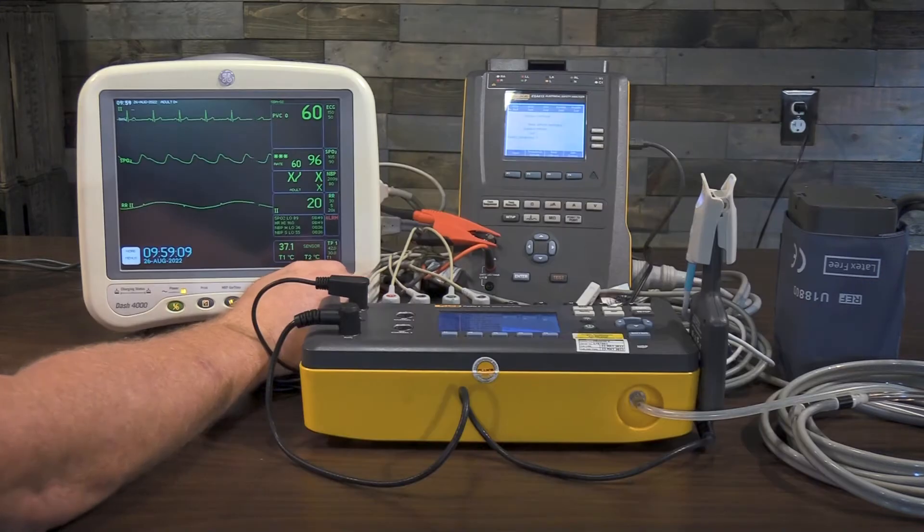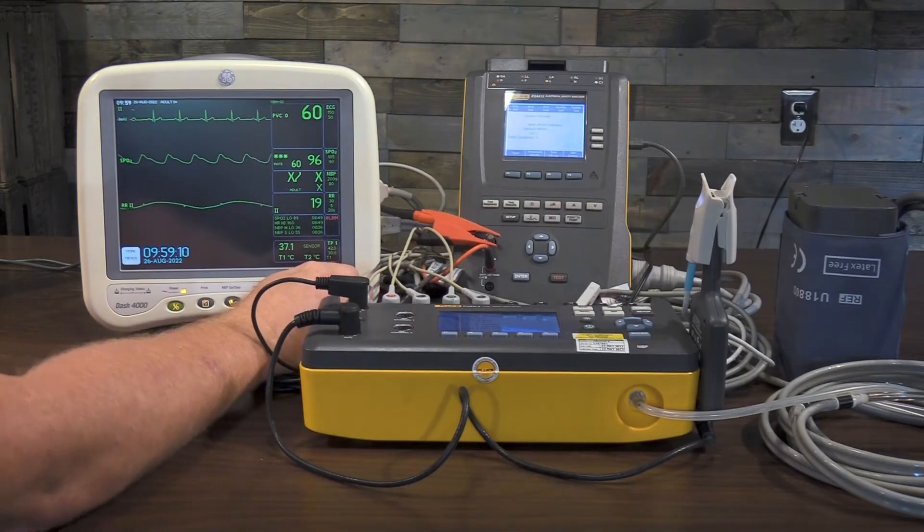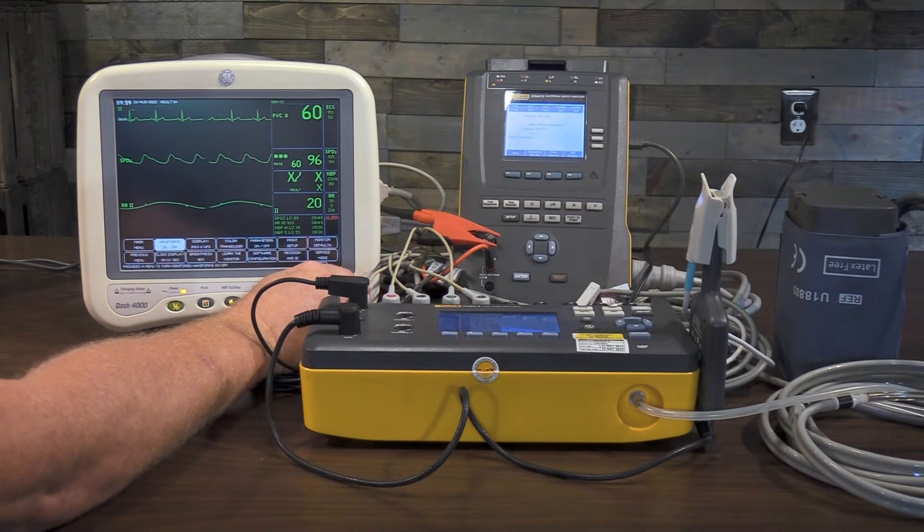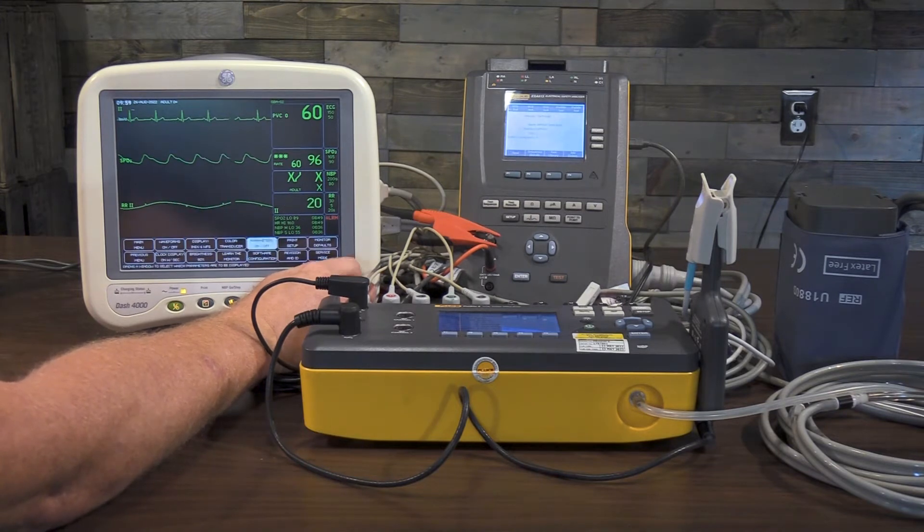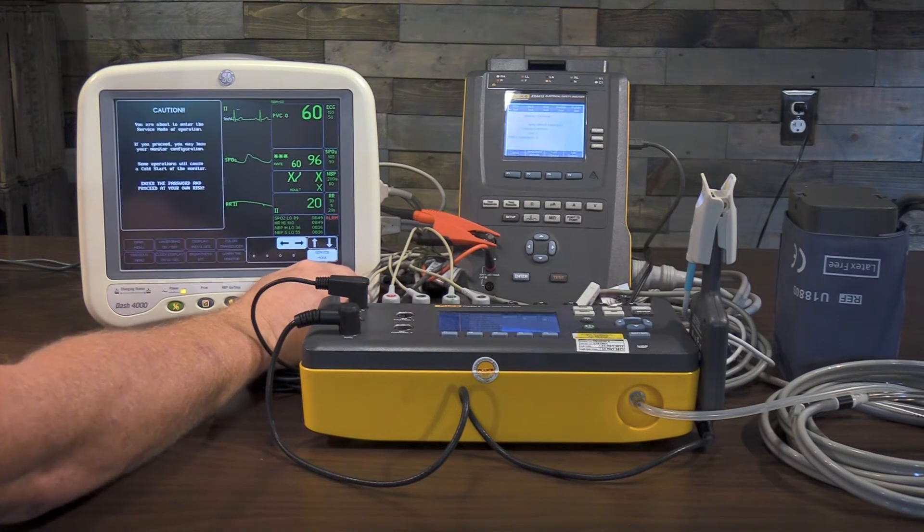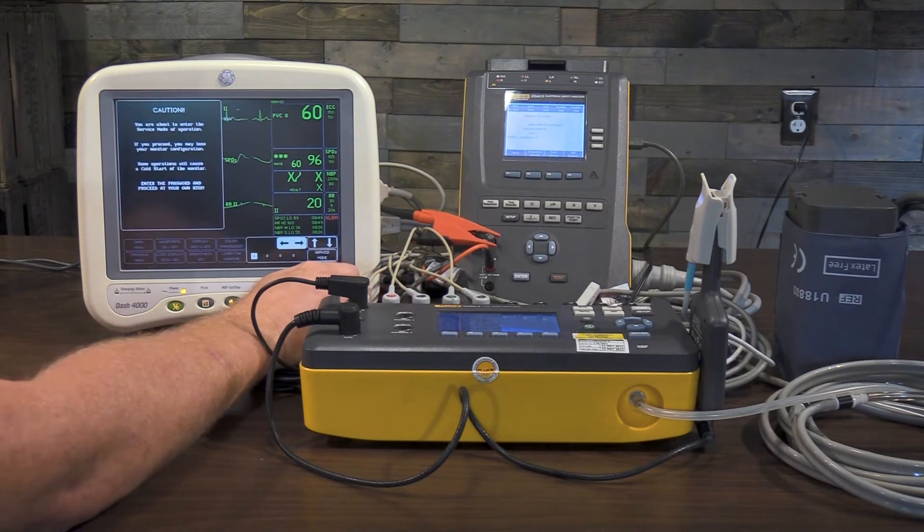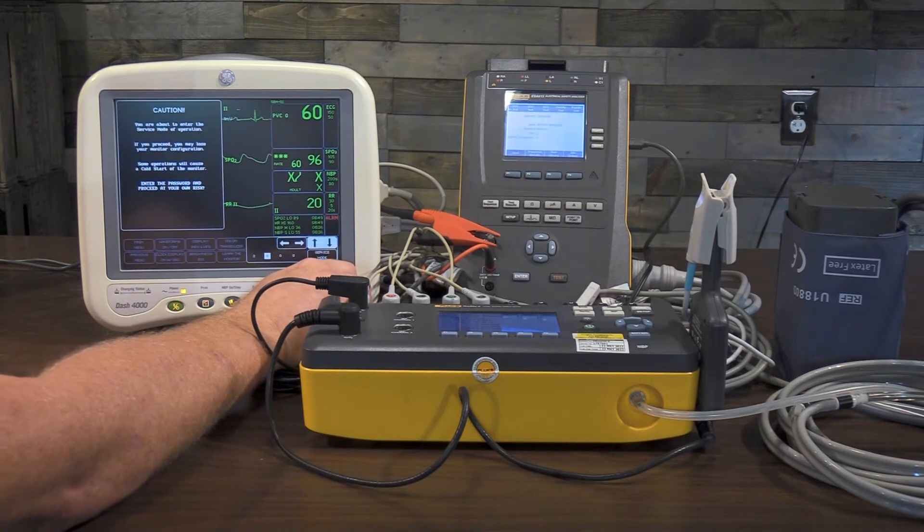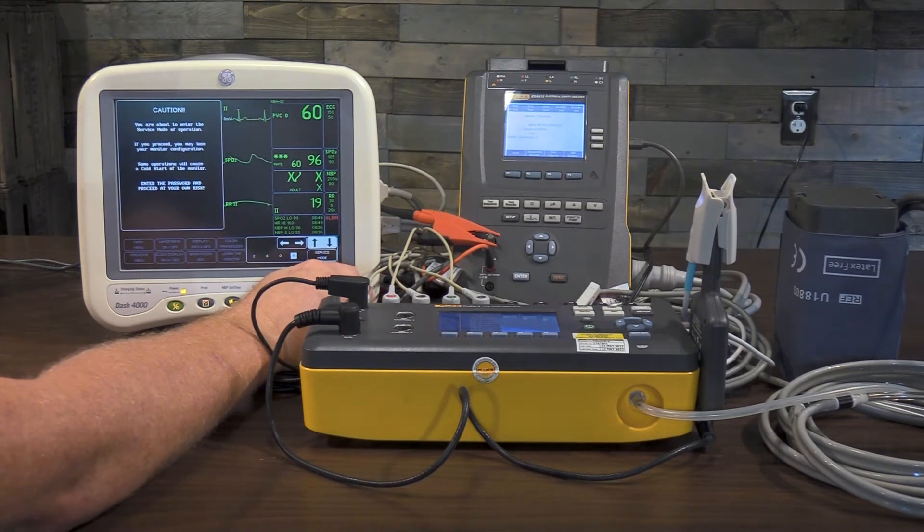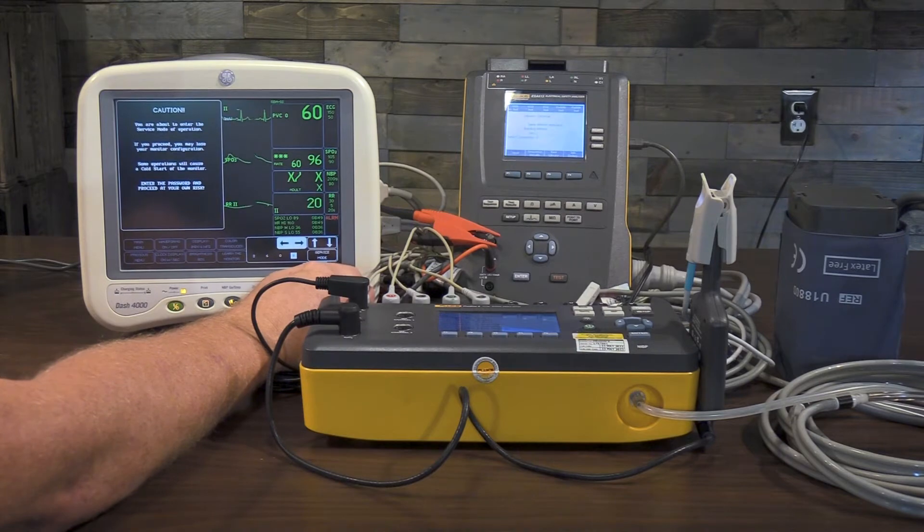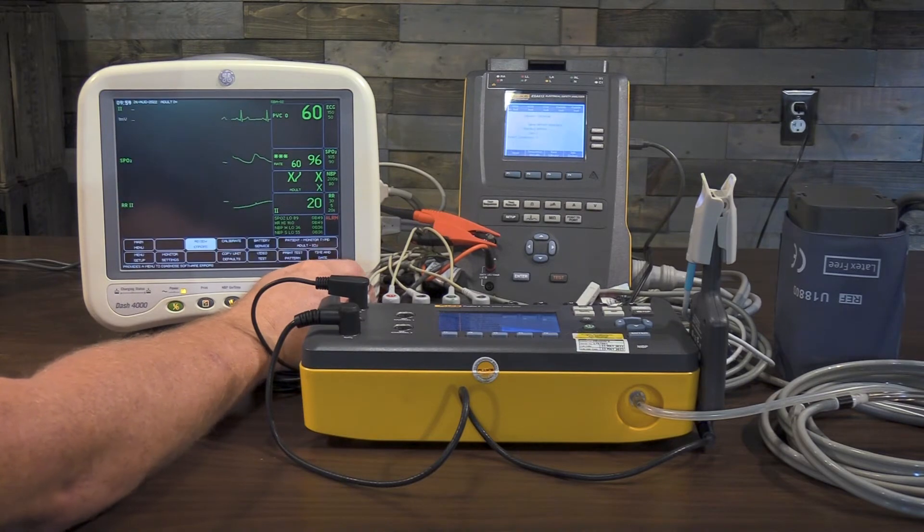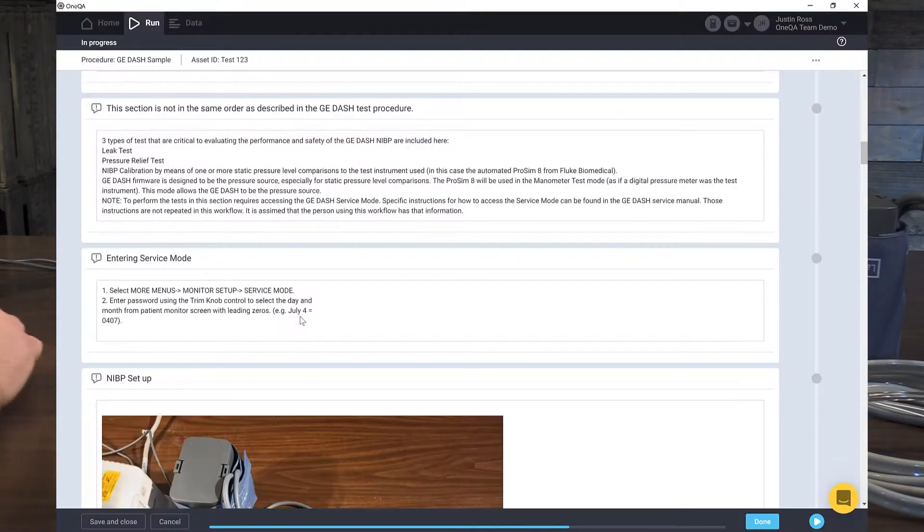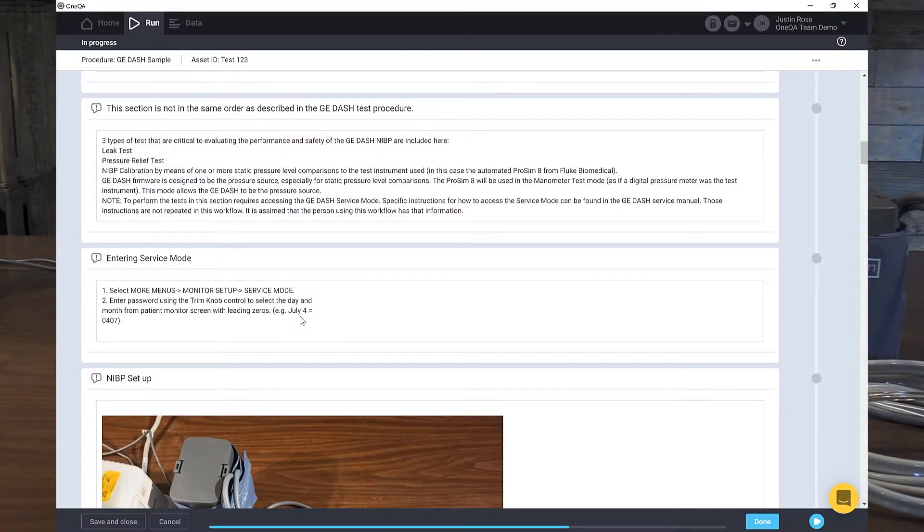And now here's how to enter the service mode. So let's go ahead and do that. We'll follow the instructions here. We'll go to main menu and monitor setup. Setup, service mode, enter the code. And we are into service mode.